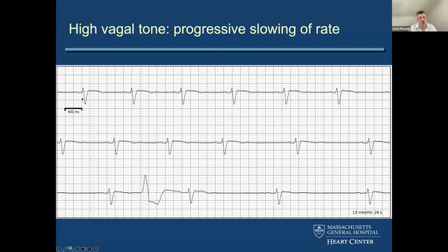And here, I would say not necessarily, because you're seeing, again, sinus rhythm, every P has a QRS, every QRS has a P, and every beat has a clear P. And you see this very slow reduction in the heart rate. So the slow prolongation of the PP cycle length with one PVC down here is more consistent with bradycardia modulated by excess parasympathetic tone. So even though this person has a lot of distal conduction system disease, it is not clearly in play in the bradycardia we see on this tracing.